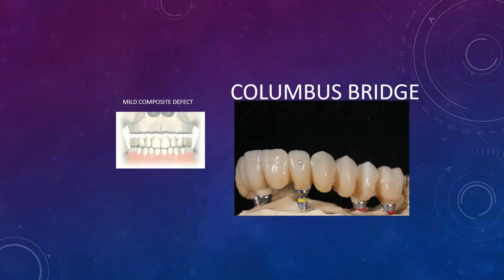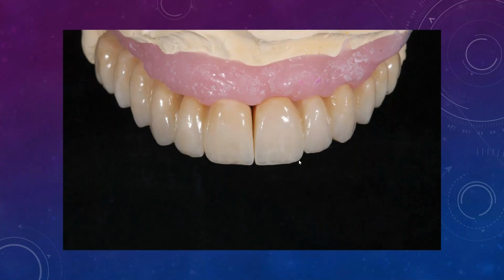In my opinion, this is one of the harder restorations to accomplish, because you're not just dealing with sticking a bunch of teeth in there and being good with it. From the clinical standpoint, you have to address every single papilla for this particular patient. And clinically, it can be very, very challenging. Not to say that on the laboratory side it's a piece of cake, but clinically, it can be quite problematic to make it look good as well. This case, pictures were sent to me by my buddy in Greece, Demetrius, and he does some amazing crown and bridge work.